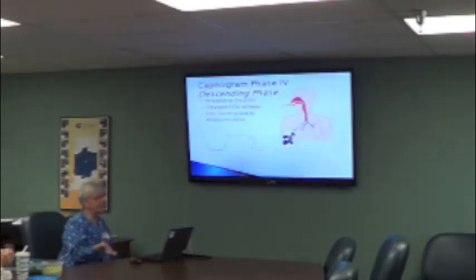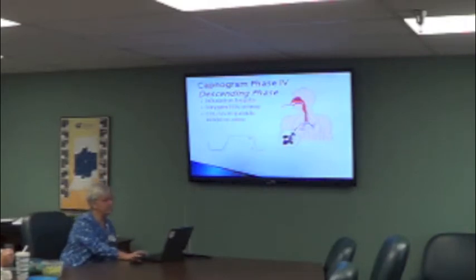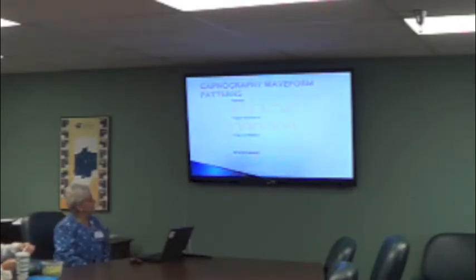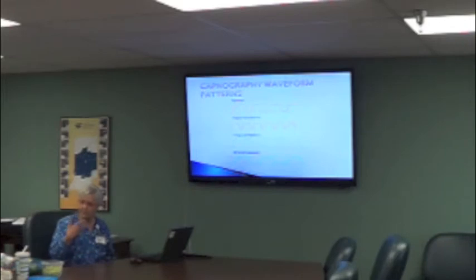Then the next part of it is they're starting to inhale and they go back to no gas exchange. There's different conditions that cause the waveform to change, but you can also go by your numbers. There's a normal waveform at the top. When you hyperventilate, you're breathing faster and you're blowing off your CO2. Have the patient breathe into a bag so they rebreathe their CO2 and increase it. So if you breathe fast, then your CO2 is going to go down. It's an inverse ratio.